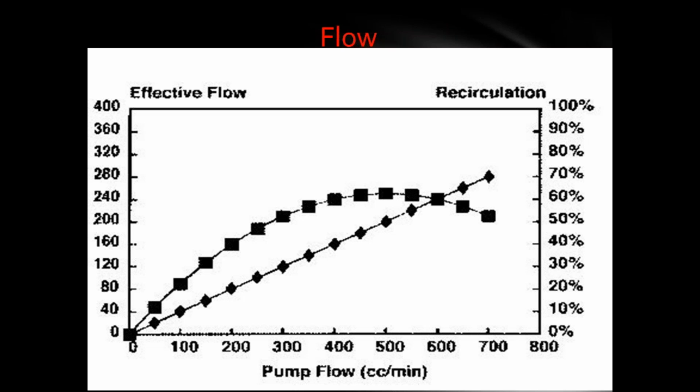That is what we call it, and that situation we keep on varying from time to time in the same patient because of patient position. Suppose patient position varies, this recirculation can change. So that's the reason whenever the patient's saturation drops, you have to decrease the flow a bit and see what happens. If the saturation remains the same or increases, keep on doing that till the time the saturation starts dropping. Okay, that is what we call defining the curve.